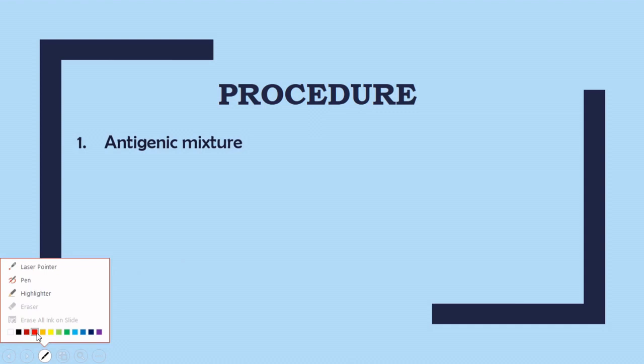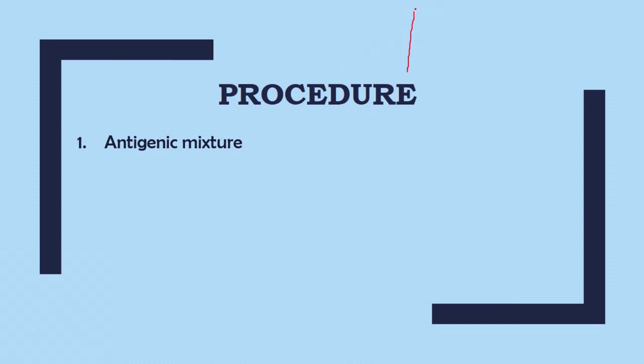Please understand, in the procedure we take an antigenic mixture and we are not really charging that antigen. Let me try making a diagram for you all, although I have a pictorial view that I will show you later. We take a glass slide, and we have a gel poured onto the glass slide. That is a preliminary requirement in any electrophoresis, including immunoelectrophoresis, that we have to have a gel, and in that gel slab we are going to bore a well. So where exactly should we bore a well?